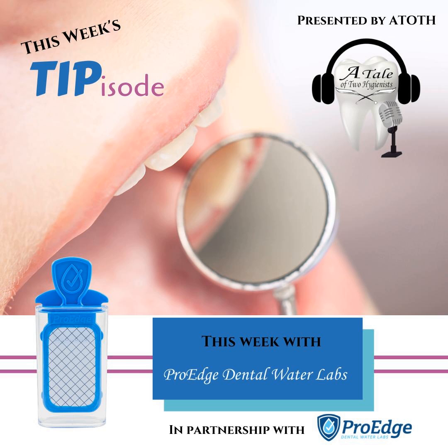We've learned that dental unit water lines get really contaminated, and the contamination happens because dental water lines are small and the water sits stagnant for 99% of the time. And the way we use water in dental unit water lines, it only moves downstream a few inches and the biofilm reattaches. Hygienists know the story of how biofilm grows, reattaches, detaches. So that's why we test our water. We want to make sure that the treatment programs and protocols we have in place are effective, so we can sleep good at night knowing that our patients are protected and our reputation and our practice are protected.